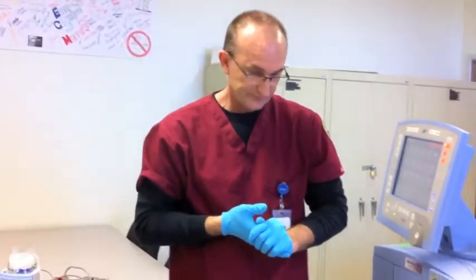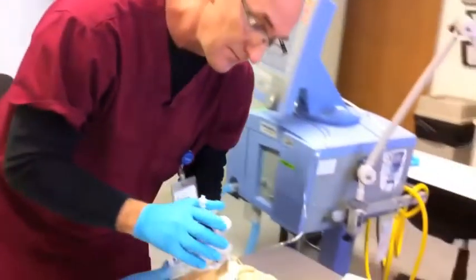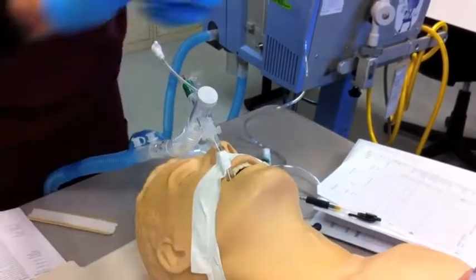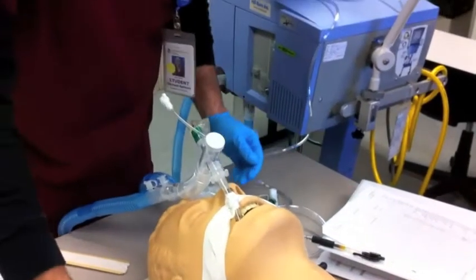Next, he's going to perform airway care. He's going to observe the tube placement and change the tube or tape position if necessary. The tube is at 24. He's going to check the cuff pressure — the cuff pressure is at 25, which is in the green.